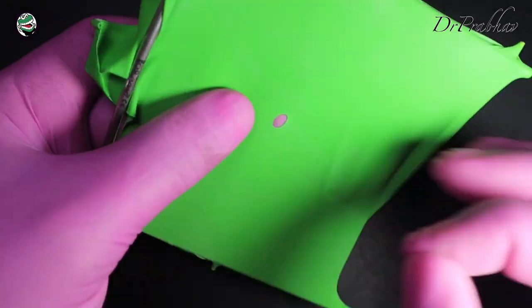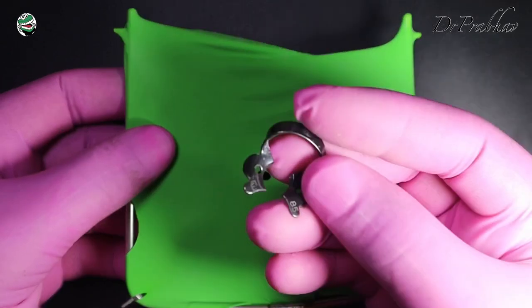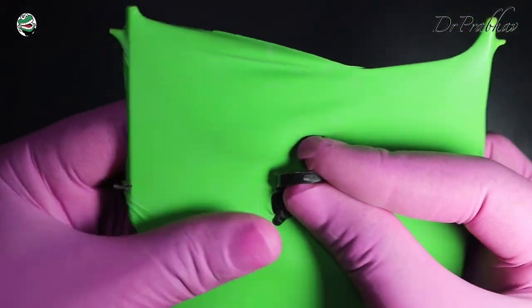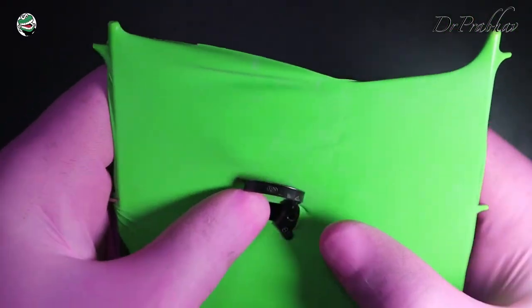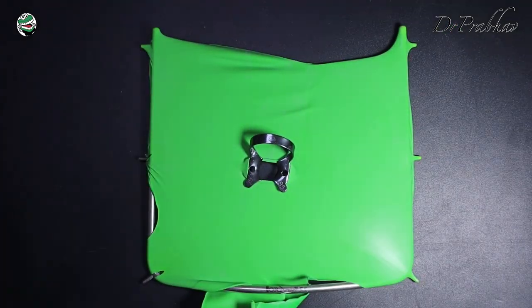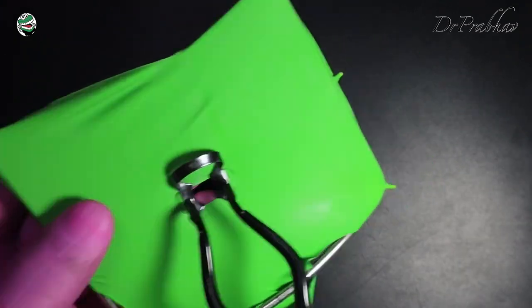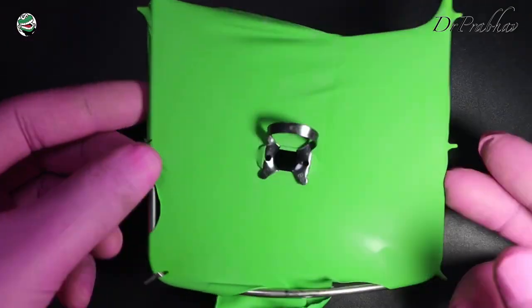Now we can punch the hole in the center for the molar, tooth 85. So we will follow the method of engaging the clamp first on the rubber dam sheet and making it an entire assembly that would be placed on the tooth that we desire to operate.